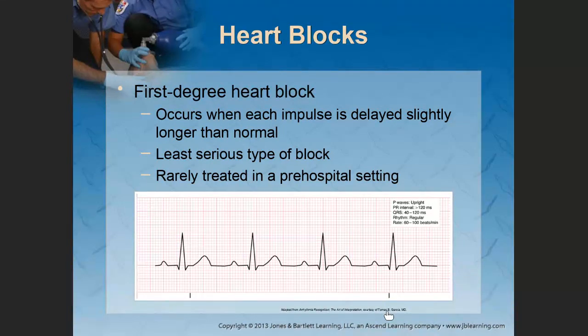Come on, I don't have all day. Answer the question. We need to check our pulse. Okay? When we check, the pulse is absent. So there is no pulse, but we're seeing that rhythm on the monitor. What is this rhythm? So no pulse is present, but we can see that rhythm. What is this called? Mentioned it earlier before we went to lunch. Can anybody figure that one out? Any answers?